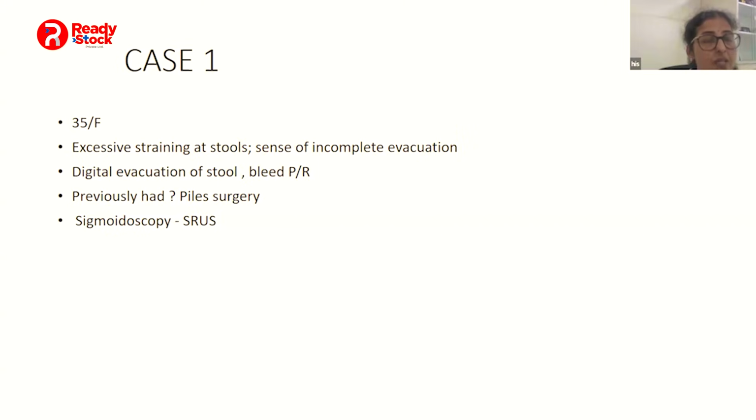So if he or she expels, we consider it as a normal manometry, normal balloon expulsion. Okay, so we can give the report as normal propulsion. Yes, normal. Like I said, if you look at only simulated defecation, if you don't move ahead to the next parts, 30 to 35% will be labeled as dyssynergy if you're only looking at their attempt to defecate, because by the time they come to the fifth step, they're a little more comfortable with the procedure also. So you will find a true dyssynergy at balloon expulsion and not at simulated defecation. So you can give it as a normal balloon expulsion.